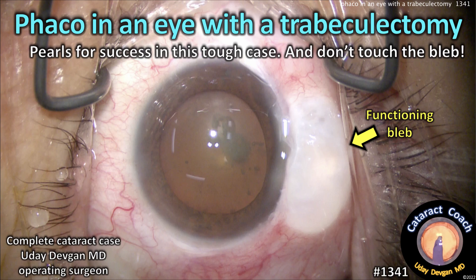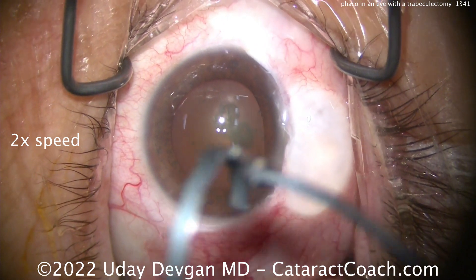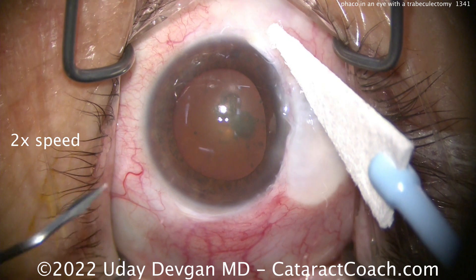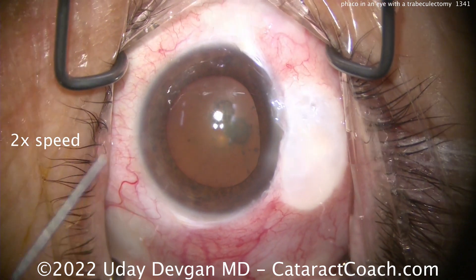CataractCoach.com. FACO in an eye with a trabeculectomy — here are some pearls for success in this tough case, and don't touch that bleb. Here's the speculum going in carefully; this is that big bleb. Don't put that fixation ring on the eye — you don't want to damage that bleb. Just use a soft Weck-Cel sponge away from the bleb to help fixate the eye.